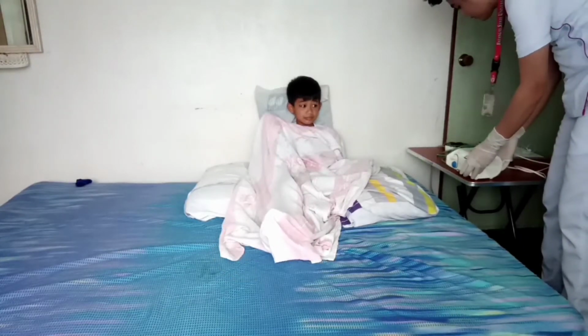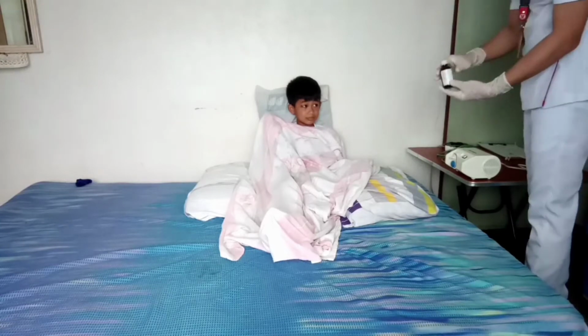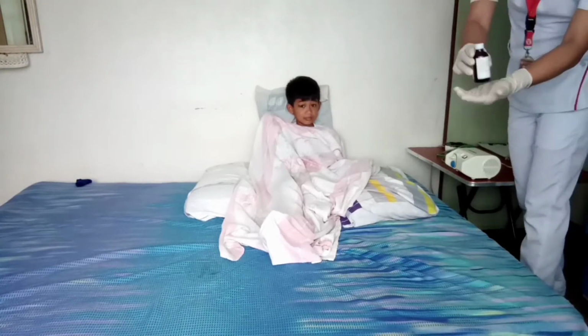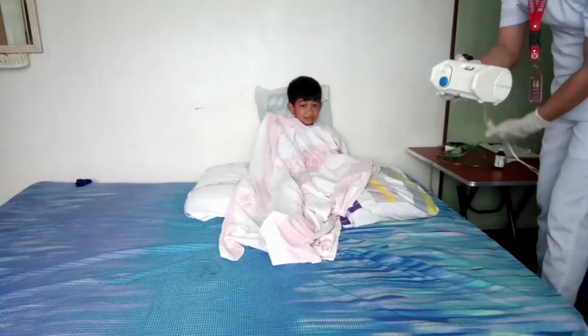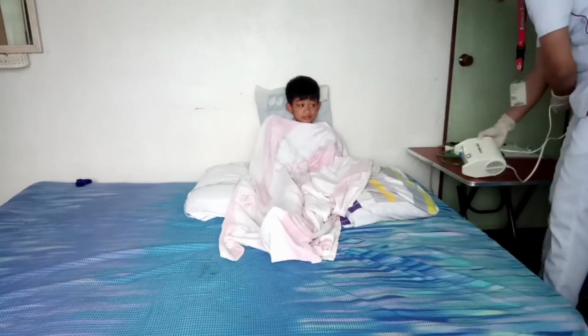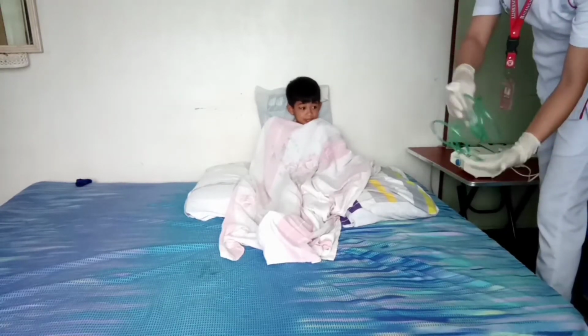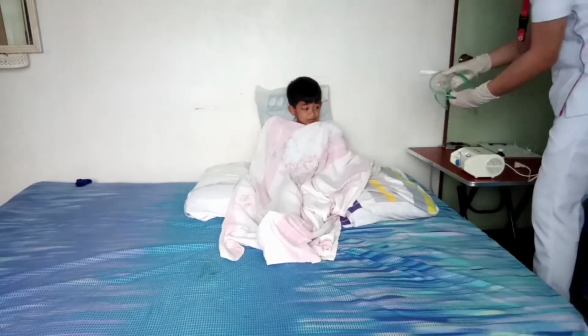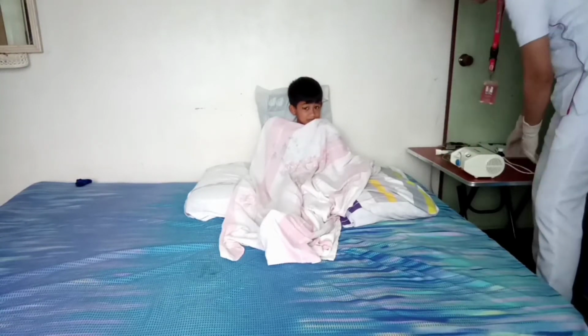And then, I will gather the equipment such as the nebulizer machine or neb machine, neb tubing, neb cup, the nebulized medicine ordered by the doctor, and the delivery device. It is to ensure the proper delivery of the medication.